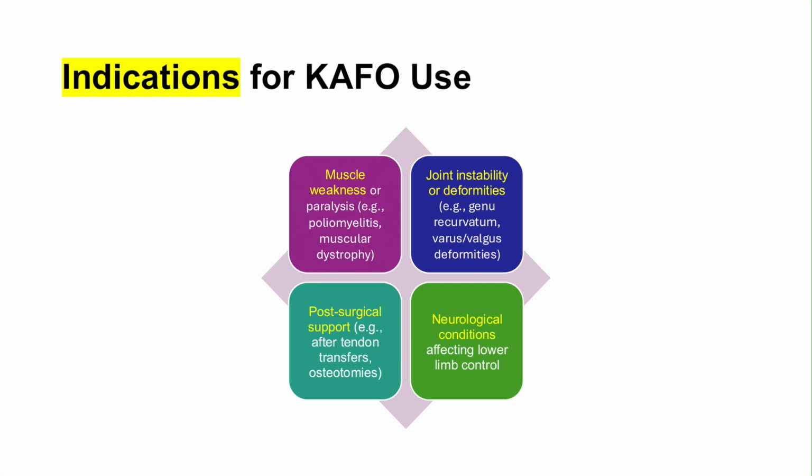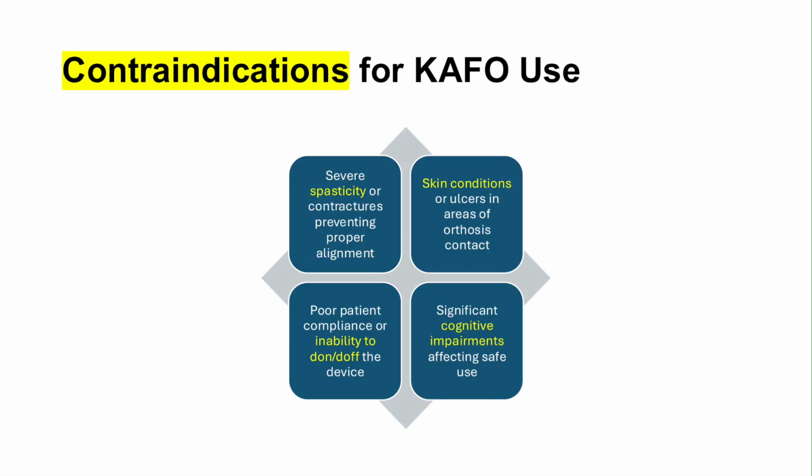However, KAFO are not a one size fits all solution. If a patient has uncontrollable spasticity or fixed deformities, fitting them properly becomes very difficult. Likewise, someone with a skin ulcer or pressure-prone area might suffer further injury from prolonged KAFO use. So people with a skin problem cannot use KAFO, it's very difficult for them. It's also crucial to consider cognitive and functional capacity, and patients who are unable to independently manage their device may face significant safety risks.